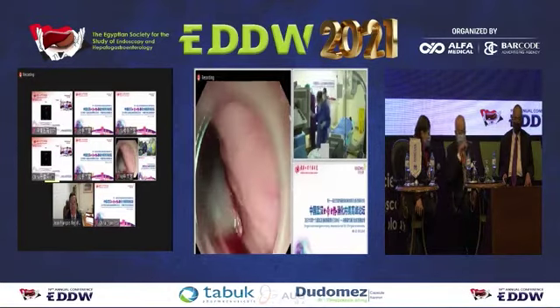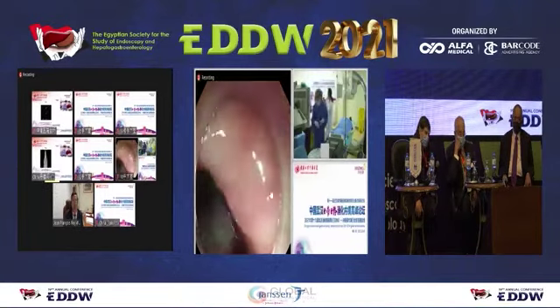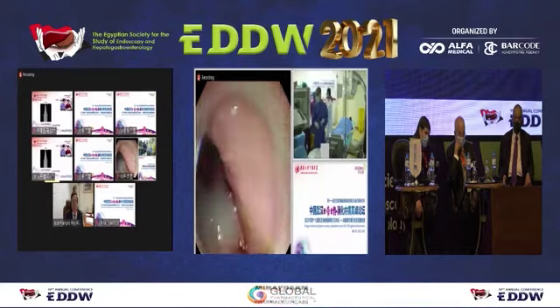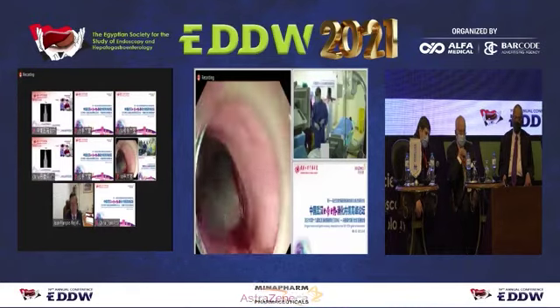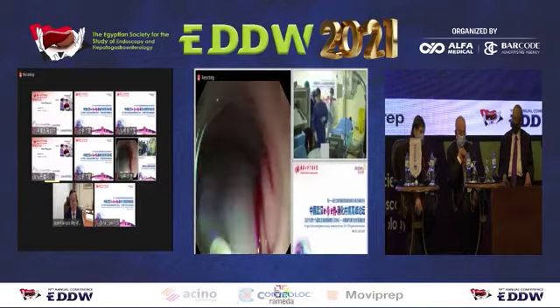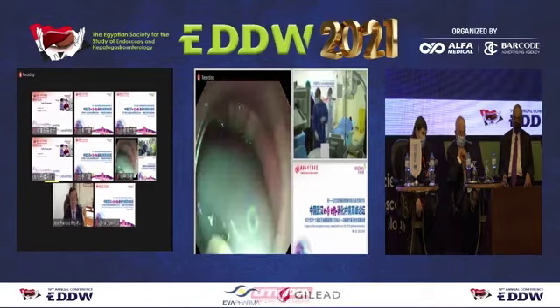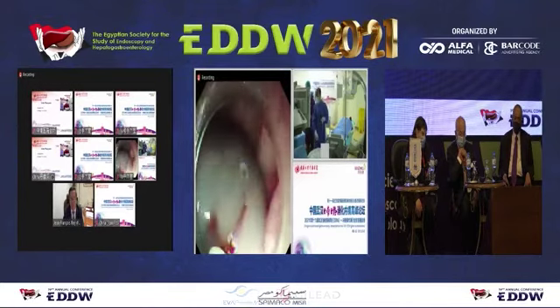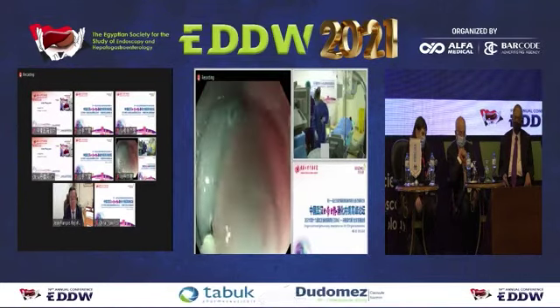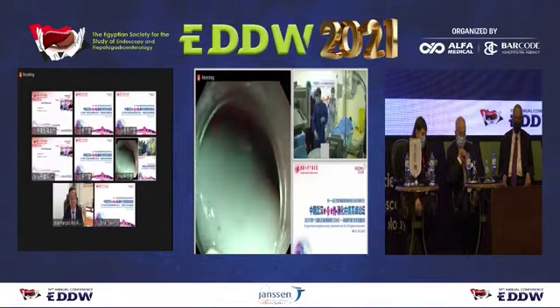Upper gut endoscopy showed narrowing and shrinking of the cardia. EUS showed thickening of the muscular layer, about 3.7 millimeters. X-ray also showed narrowing and shrinking of the cardia. This procedure is POEM, and it will be performed by Professor Guiqi Wang.